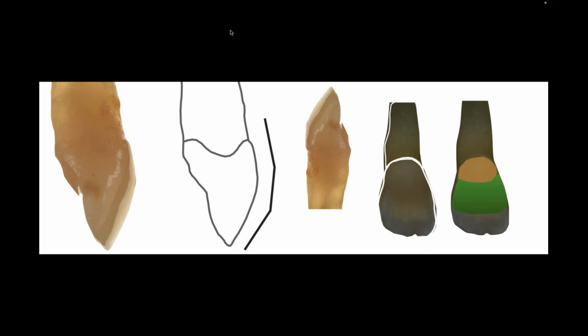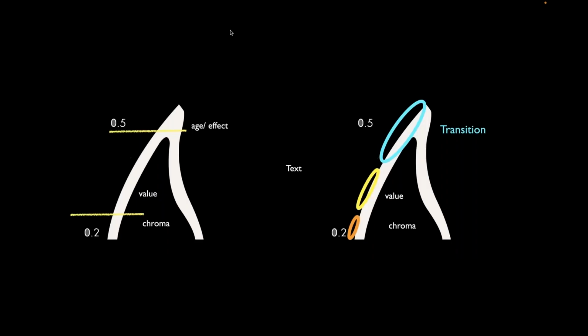So that means that now as I'm building my teeth, I'm actually thinking them zone-wise. And again, this is why you need more than one enamel, because you really need to finish the zones with the coloration that you want those zones to have. So I'm thinking of, again, higher chromas in the cervical, higher values in the middle third, and then more translucencies, values, or chromas in the incisal third, depending on the effect of the age that I'm looking for, okay?